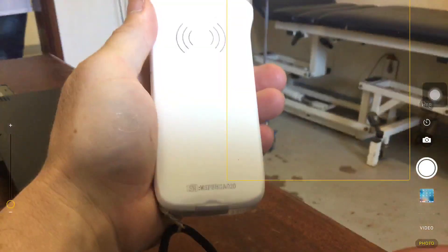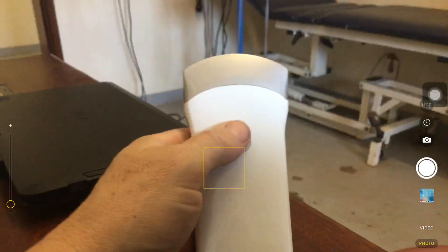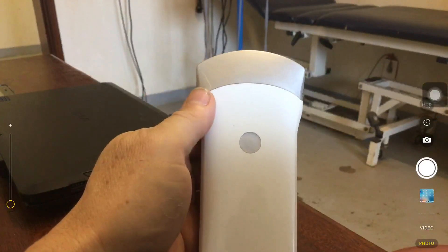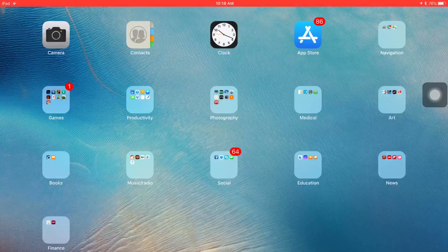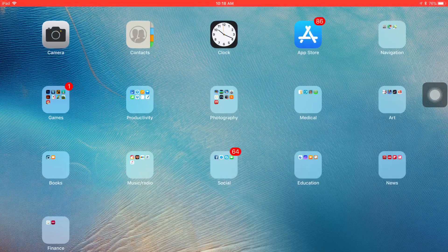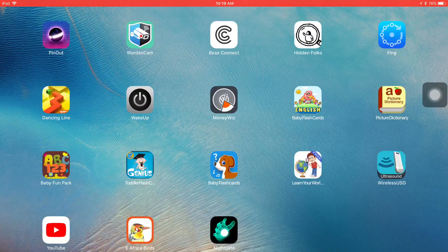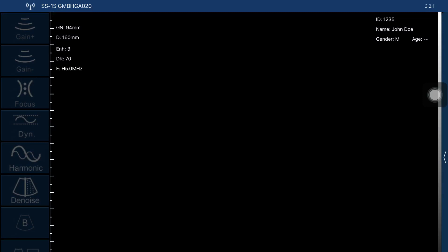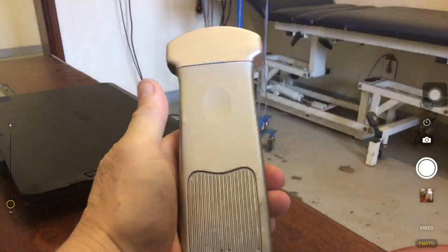Here's the Sonostar probe. You can see the serial number, which is also the password for the Wi-Fi. There's a single button — you push the gray button and it turns on the Wi-Fi signal. You can see the Wi-Fi network appear, then you open the app called Wireless USG, and all the controls come up. You can see the probe is alive. The button also works as a freeze.